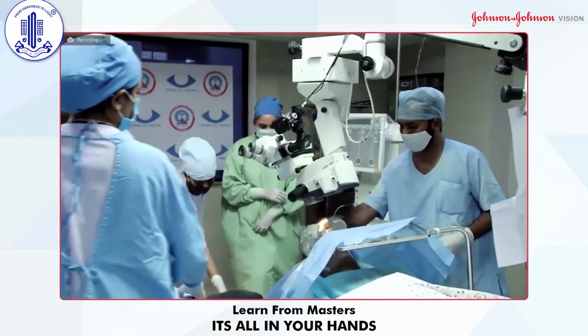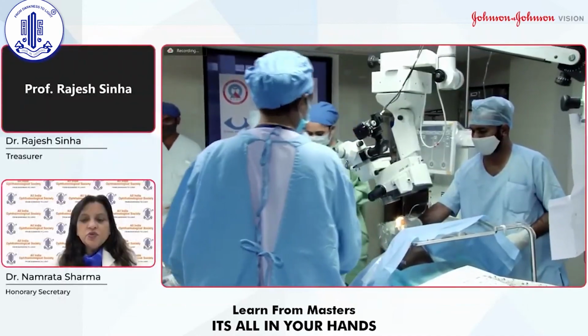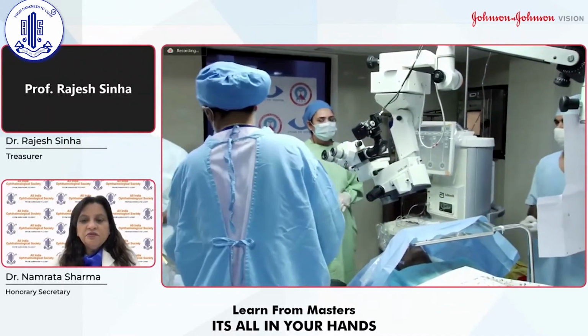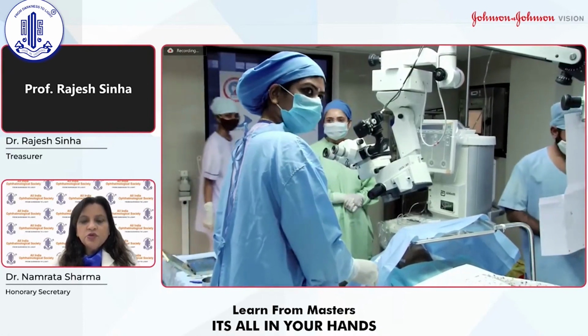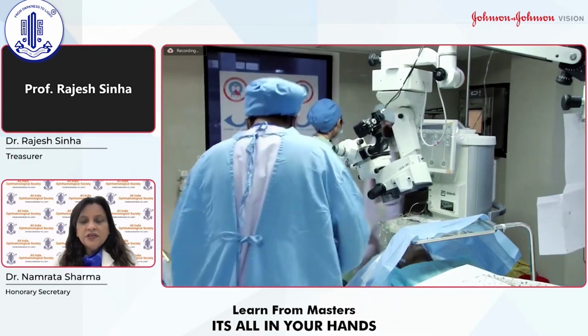So I see that there is a rod which is there and your drape is over the rod. So I think this is for the patient comfort, that the drape is put over the rod so that the patient is able to breathe. As the patient is lying down, we can see.